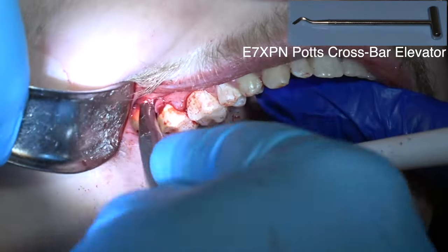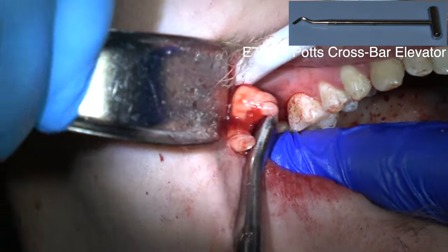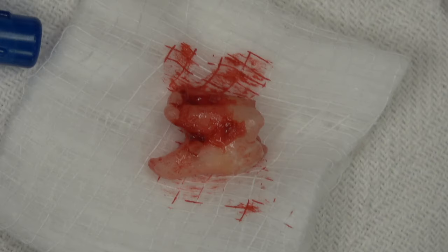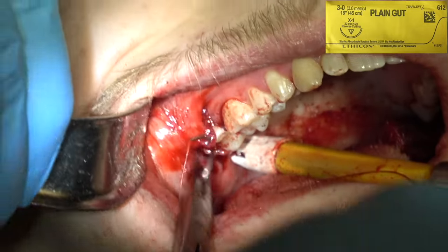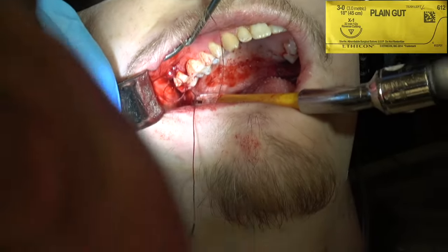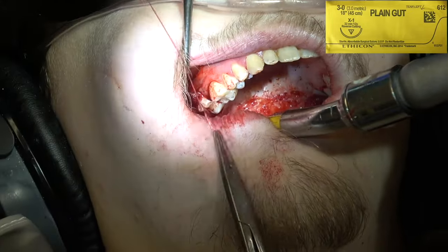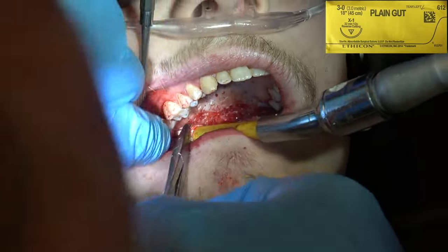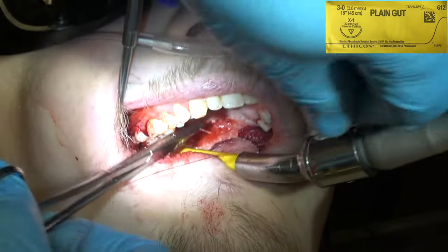There we go — look at the dilaceration on those roots, just like the horns of a deer. If he'd been a patient in my practice, we would have started watching those wisdom teeth when he was about 16 and picked the time when the root is only about 25% formed.